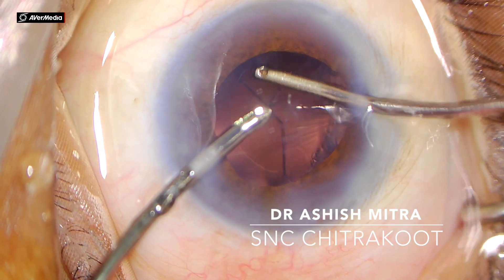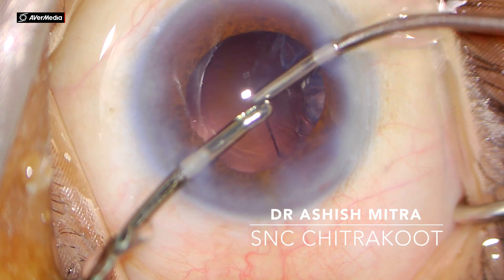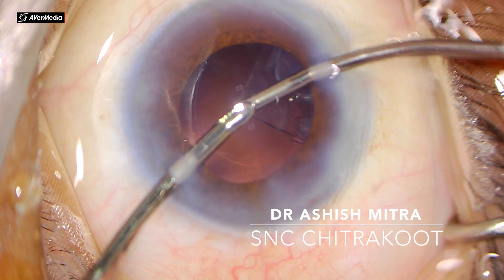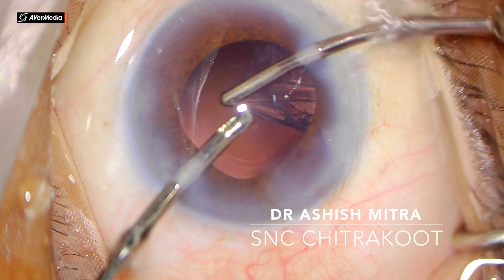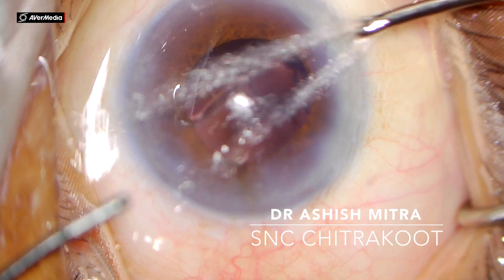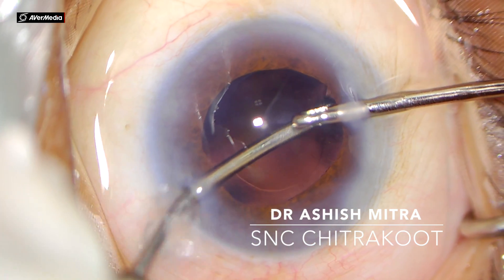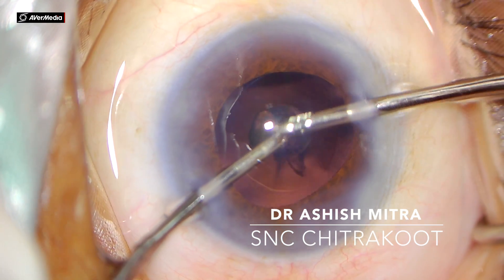For sub-incisional cortex, it is always better to exchange hands. Beginners always resist changing hands because being right-handed they feel their right hand is dominant, but once you start training yourself by exchanging hands the peeling actually becomes easier — rather than trying to peel the sub-incisional cortex from the same side. Now you can see I am changing my hands and the sub-incisional cortex was taken off from the other side. It is always desired to remove all cortex and you should not leave any bit behind.